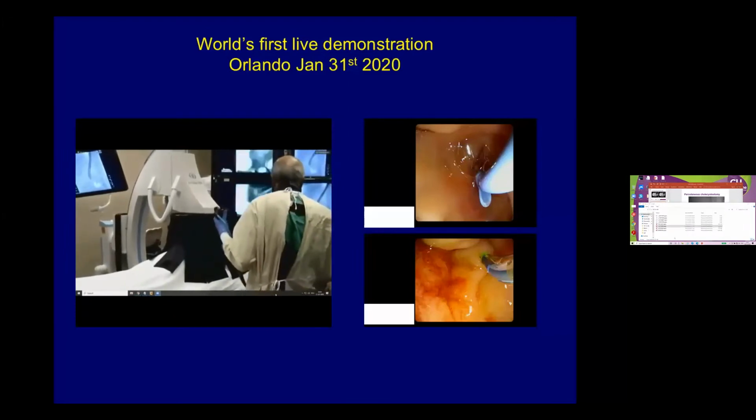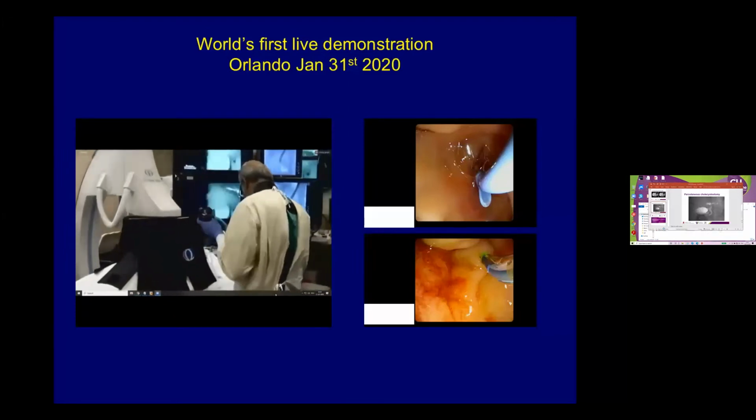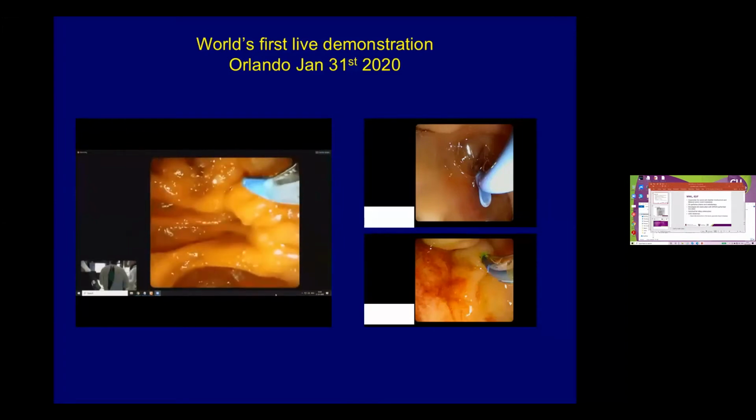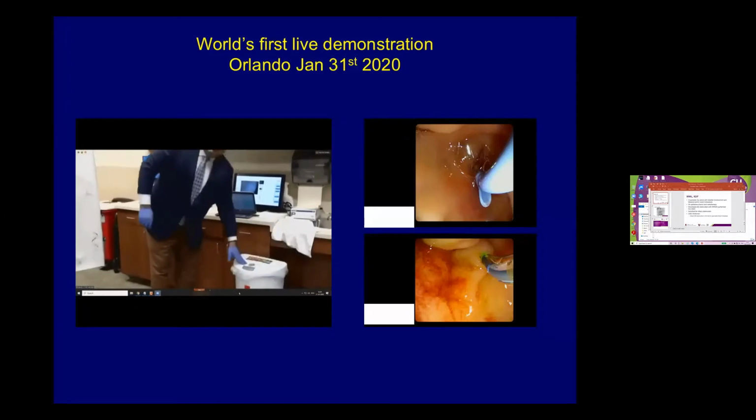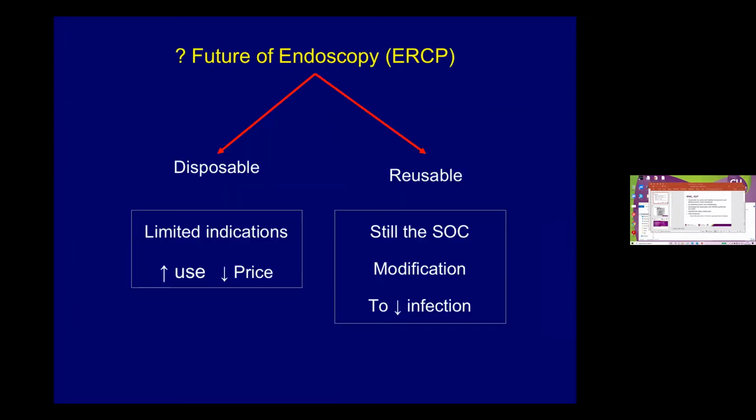This was a stenting that we did in this patient who had a biliary and pancreatic stricture. After the scope has been used, Dr. Muthuswamy is throwing it away. So this is something that is becoming possible. And in future, are we going to use this more and more? The main problem is the cost. The cost of the scope currently is about $3,000. And again, Shyam's group has estimated that unless it comes to about $600, widespread use won't be there.